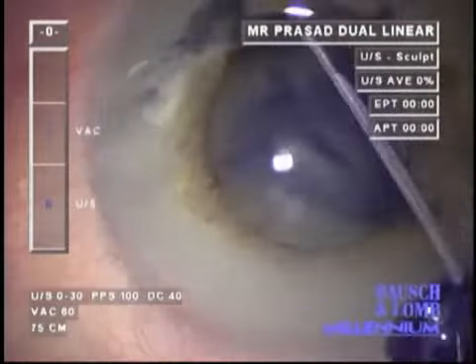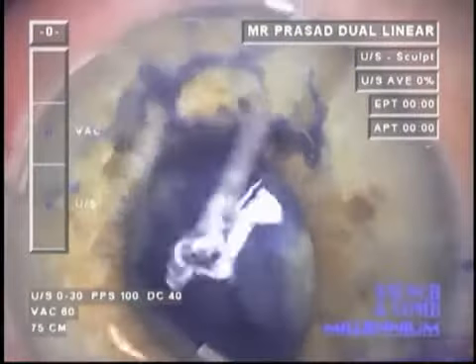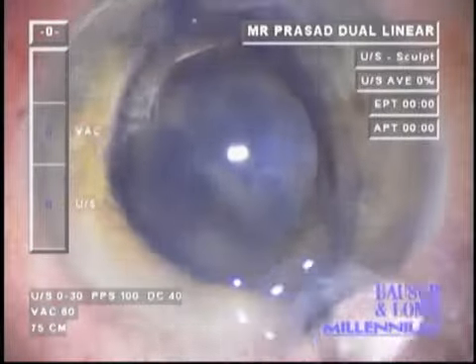Our preference is for biaxial MICS as shown here. Here is a case with a moderate pupil; the patient is on Flomax and does not have a red reflex because of a dense cataract.